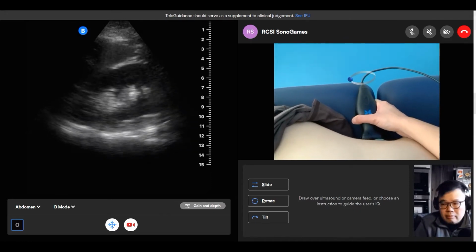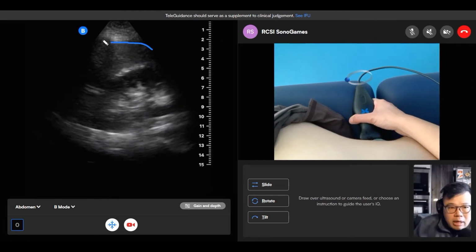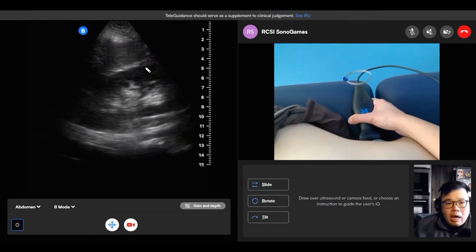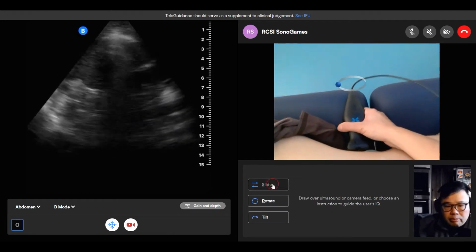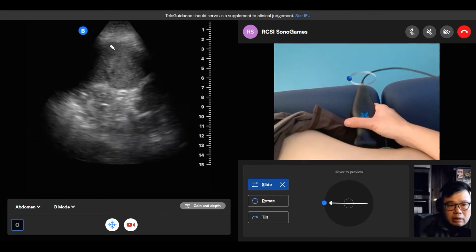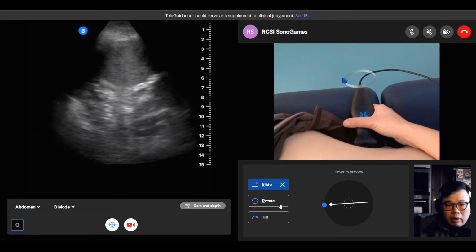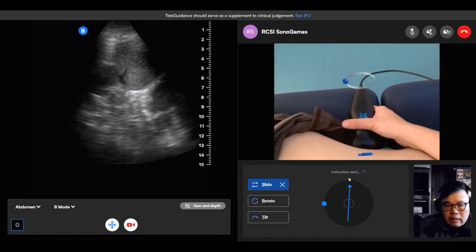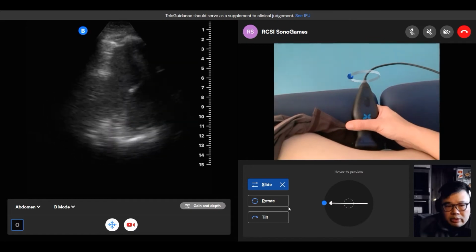Okay, so I'm looking for... Could you put the line back on for where I'm supposed to look? So you need to go up here. Okay, and so is this view that we're having right now sufficient? Not really. So you probably need to move the probe up a little bit more. Okay, so you can see the lung curtain over here coming in. If you want to bring the probe more posterior, just a tad bit more posterior.